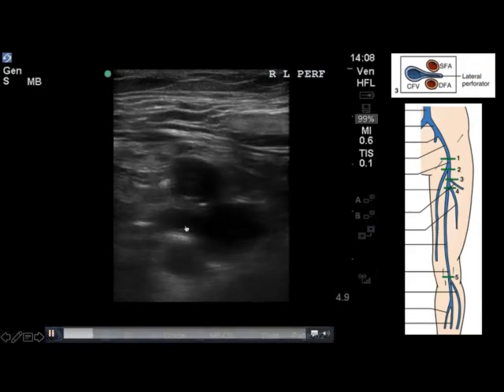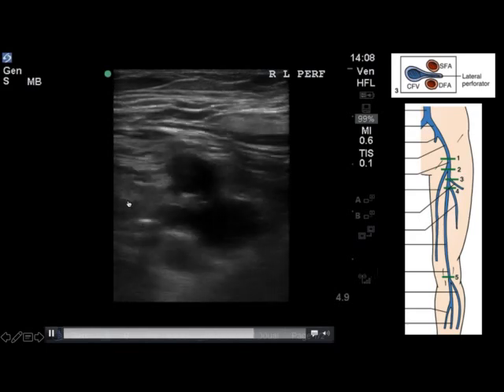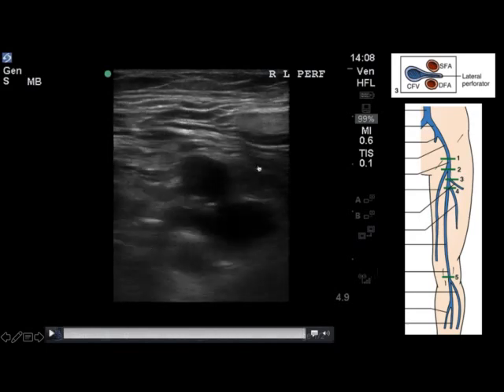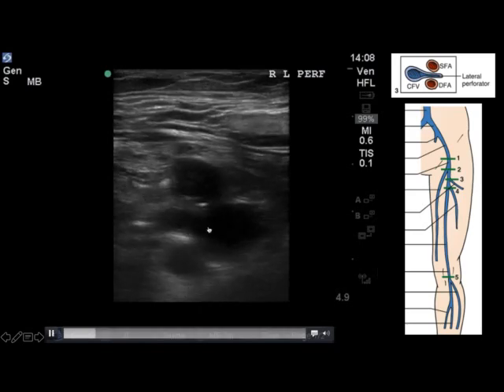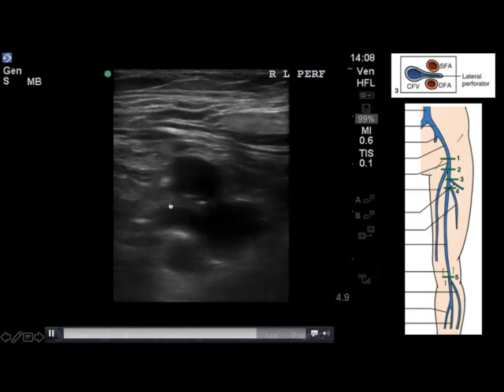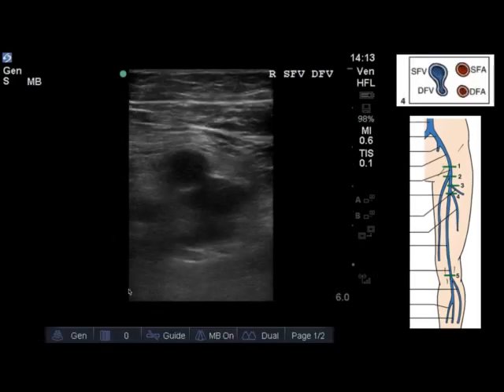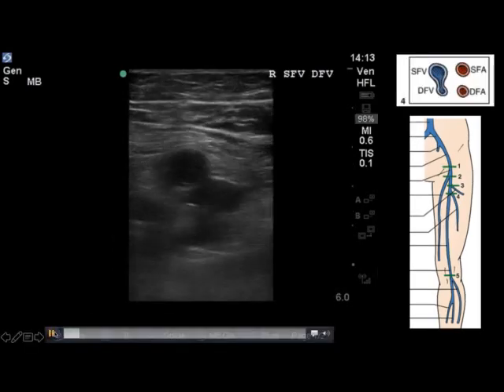The next thing we look at is the takeoff of the lateral perforator vein. The left side of the field of view is the lateral part. You have a nice view of the superficial and deep femoral arteries, the common femoral vein lying a little bit medial, and a nice view of the takeoff of the lateral perforator. We're able to compress the common femoral vein and the lateral perforator, satisfying ourselves that there is no deep venous thrombosis present at this site.